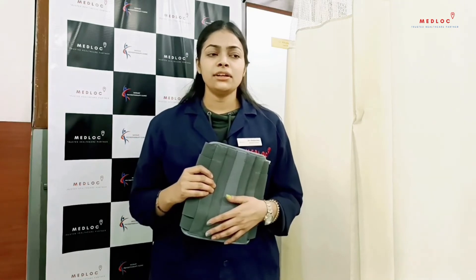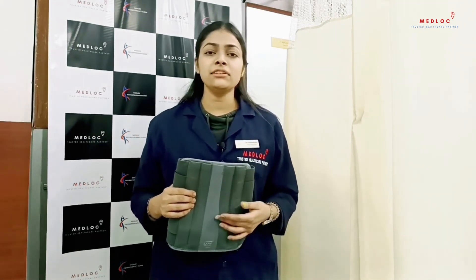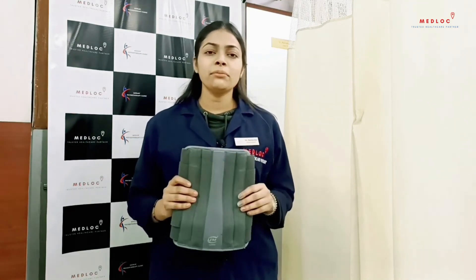When should you wear a lumbosacral belt? It is highly recommended by your physiotherapist, orthopedician, doctor, or spine specialist after surgery, or for conditions like degenerative scoliosis, moderate to severe low back pain, or postural imbalance and poor posture. In such cases, you can wear this lumbosacral belt to help your back.